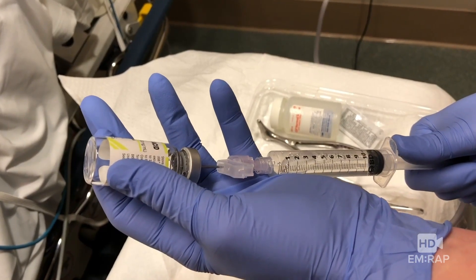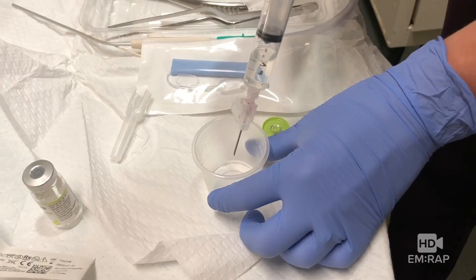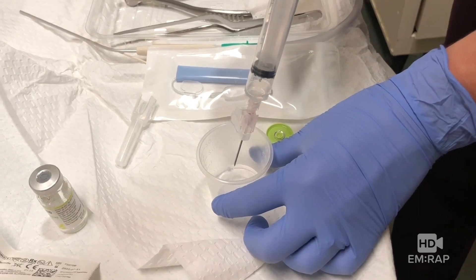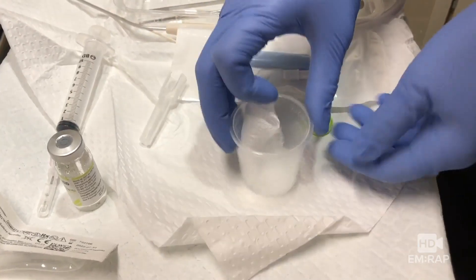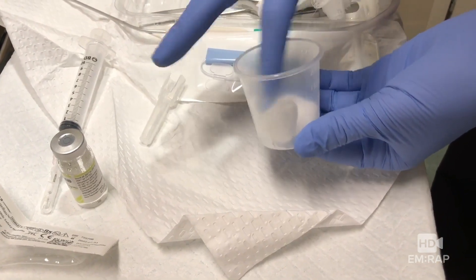After a little bit of rigorous math, that is 1000 milligrams of TXA. We'll use this handy dandy medicine cup and now we're just going to soak the gauze so it absorbs all of that TXA solution — this is just one four-by-four.